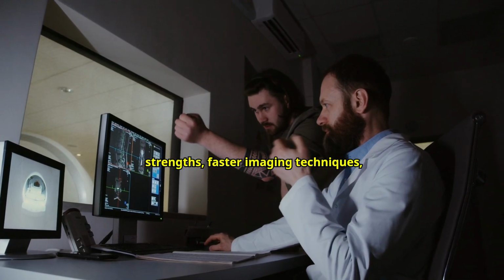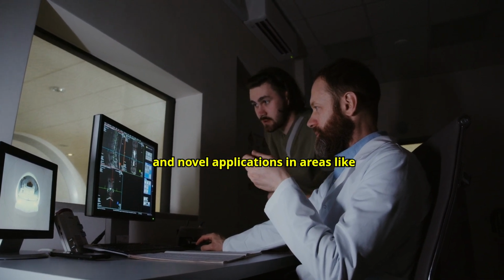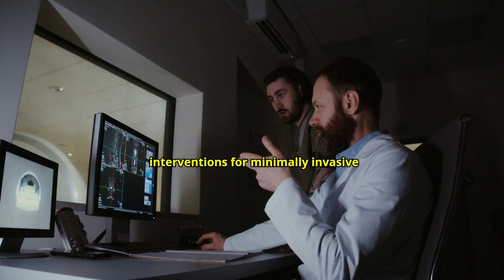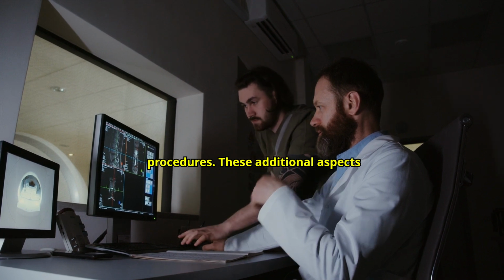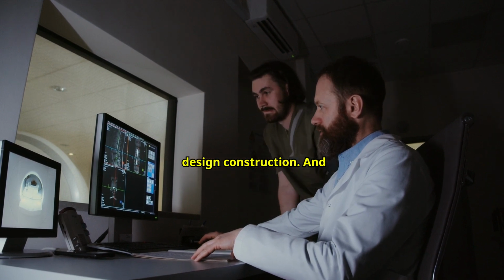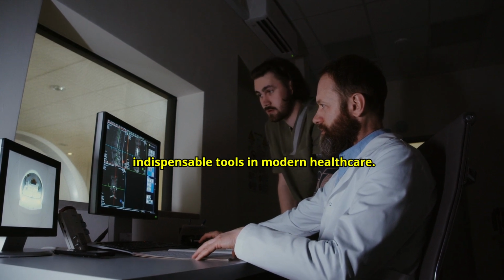field strengths, faster imaging techniques, and novel applications in areas like functional MRI, fMRI, for studying brain function, or MRI-guided interventions for minimally invasive procedures. These additional aspects underscore the depth of engineering expertise and innovation involved in the design, construction, and operation of MRI machines, making them indispensable tools in modern healthcare.